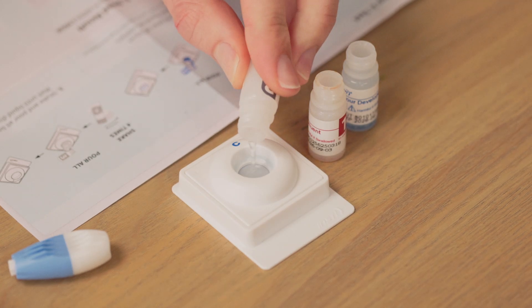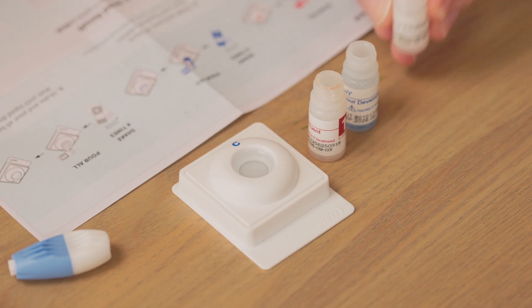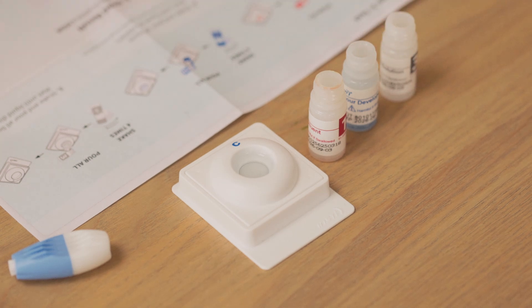Step 8. Repeat with the white bottle number 3. As soon as the liquid has soaked in, the test is complete.